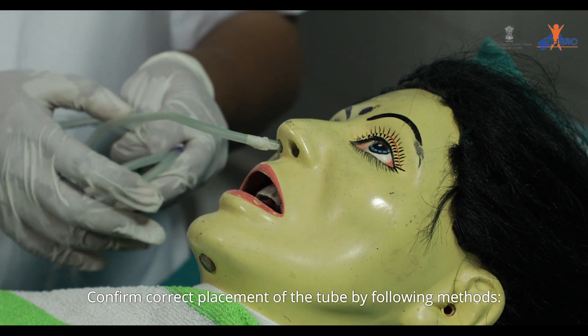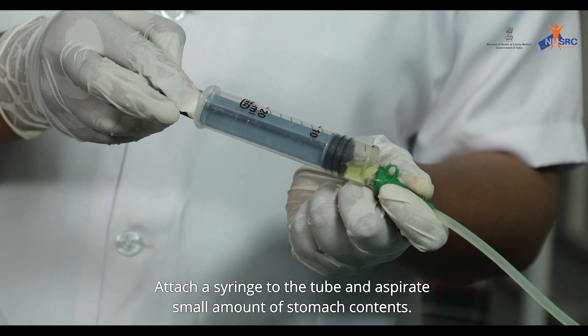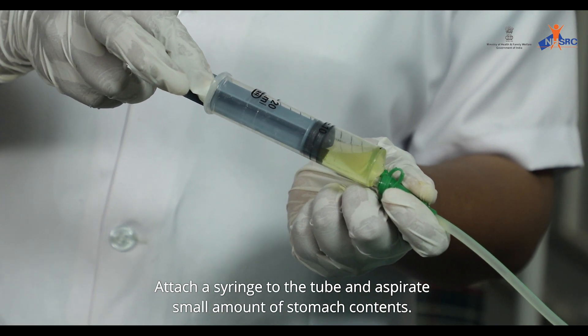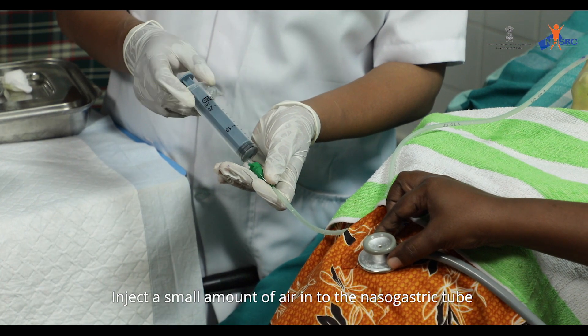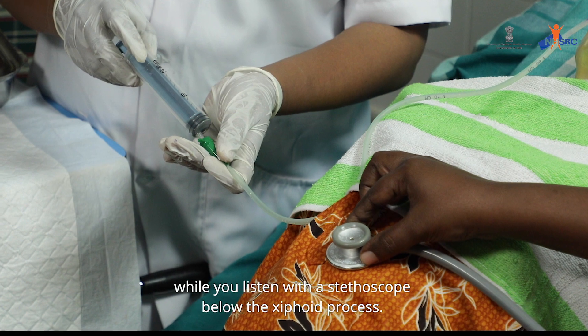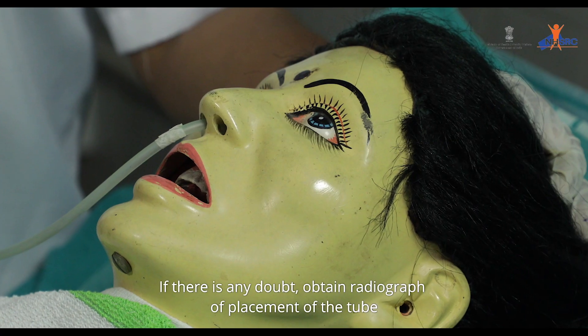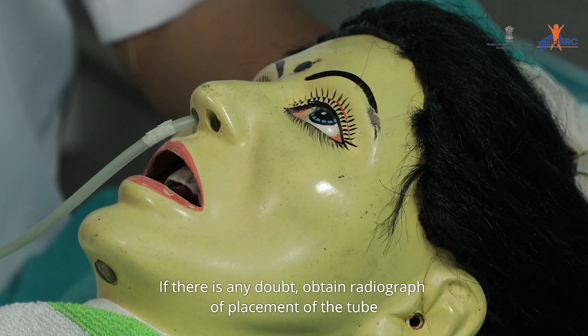Confirm correct placement of the tube by: attaching a syringe and aspirating a small amount of stomach contents; or injecting a small amount of air into the nasogastric tube while listening with a stethoscope below the xiphoid process. If there is any doubt, obtain a radiograph to confirm placement.